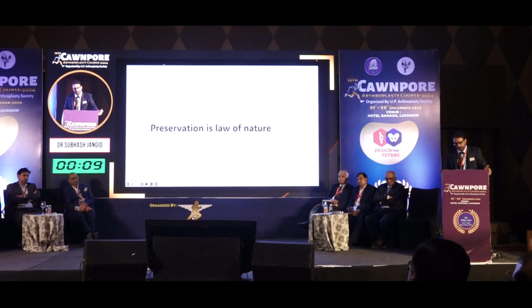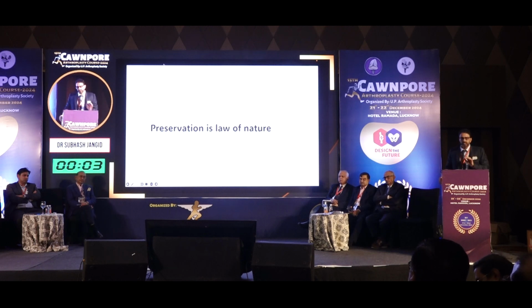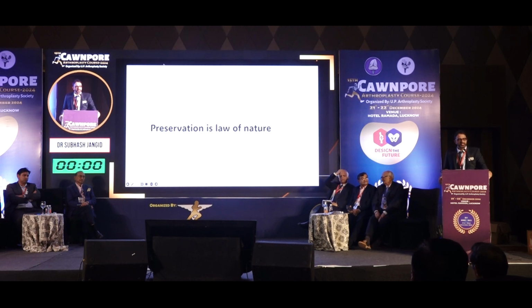So just to conclude, I will say that preservation is the law of nature, so I would like to preserve the CR, the PCL, if possible. However, as a surgeon, you should not be hard and fast. Never and always are not part of your book. You have to be flexible based on the case-to-case scenario. You can change from CR to PS or medial congruent, or then further increase the constraint. And thank you all for your patient hearing.